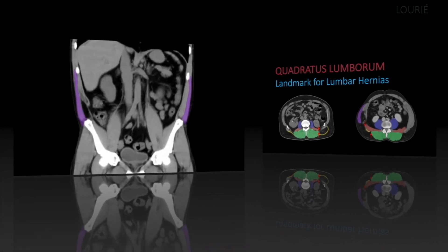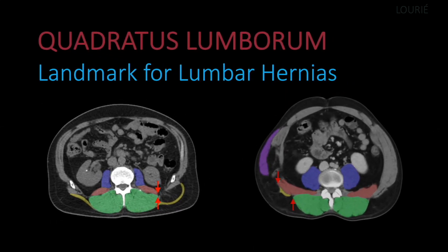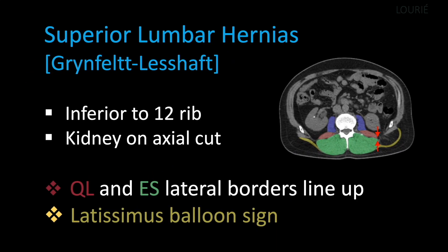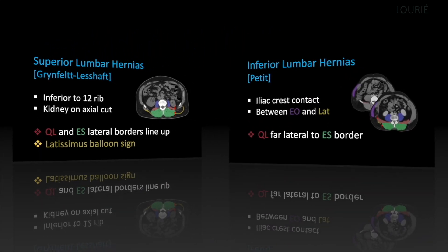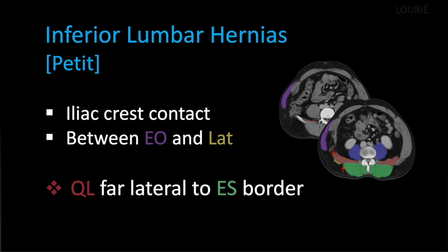In conclusion, in addition to recognizing the traditional surrounding structures, I have emphasized the quadratus lumborum muscle, which is — though underappreciated in the published literature — in my belief the key, reliable, orienting landmark of the lumbar region. To summarize: for a superior lumbar hernia, find the tip of the 12th rib, look for the kidney on the same axial cut, and using the quadratus lumborum landmark, the QL and erector spinae borders will line up in the same AP plane — and look for the latissimus balloon sign. For inferior lumbar hernias, you will see contact with the iliac crest, look for the gap between the external oblique and latissimus dorsi, and for the QL landmark, the QL will be far lateral to the erector spinae lateral border.